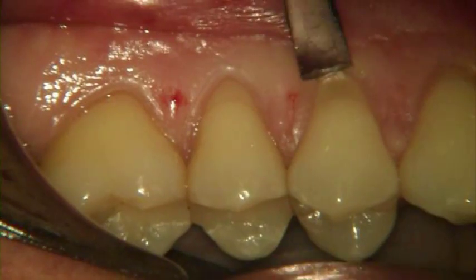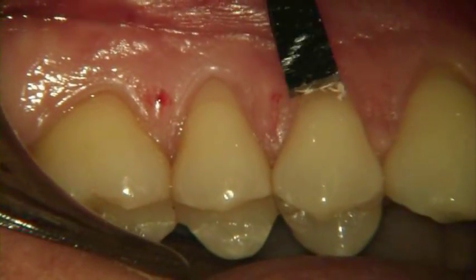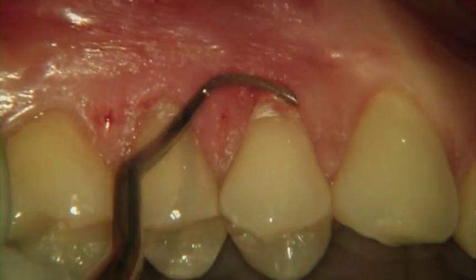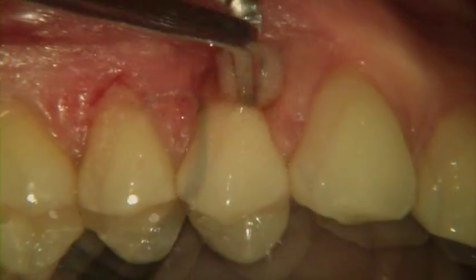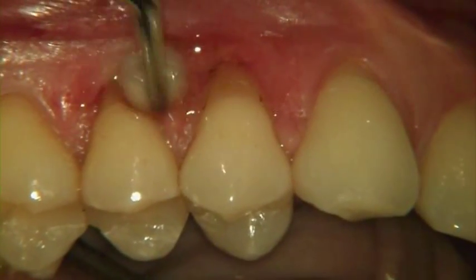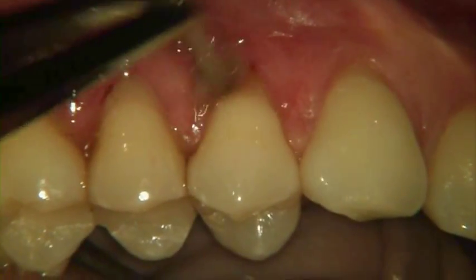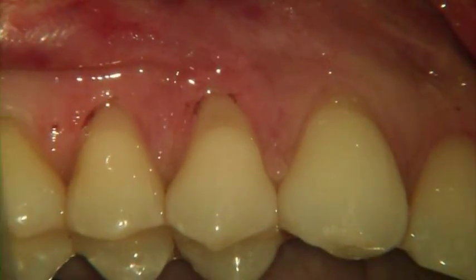Starting with a back-action chisel, the surgeon begins the root planing process. Next, a Gracie 1112 curette is used to further refine the root planing as well as to more thoroughly debride the root surfaces. The next step in root preparation is to biomodify the exposed root surfaces with citric acid to remove the bacterial smear layer. The citric acid is allowed to stay in place for approximately 2 minutes, after which sterile saline is used to thoroughly rinse the citric acid from the surgical field.